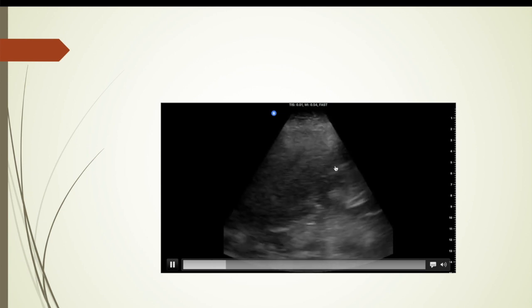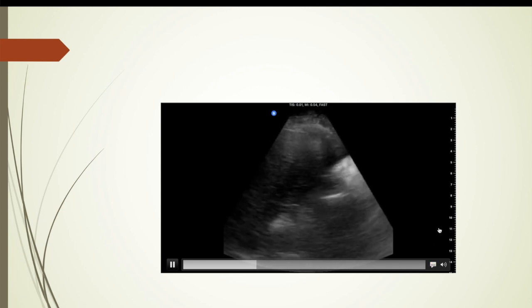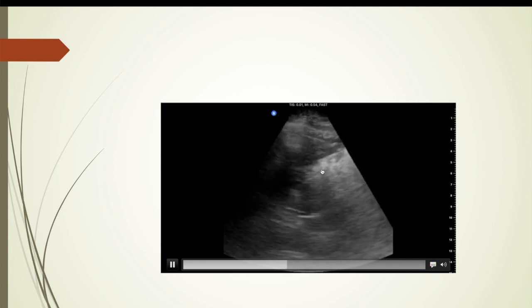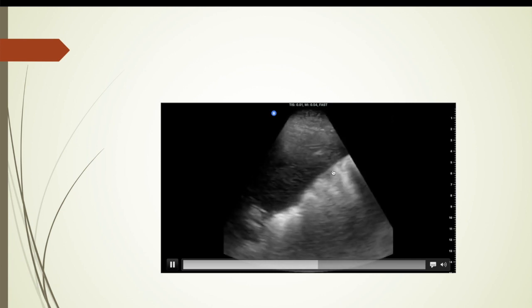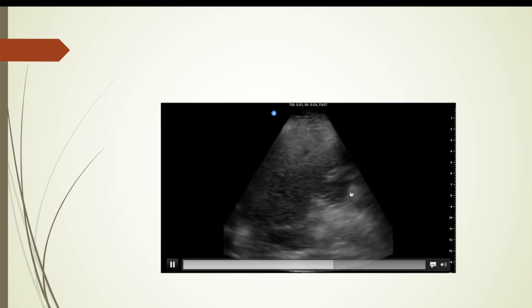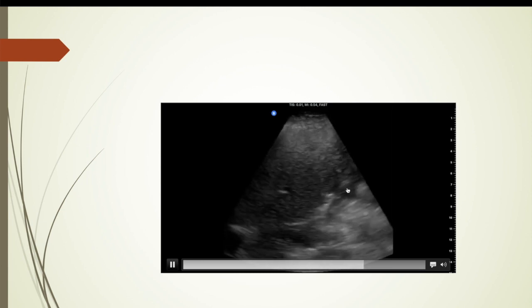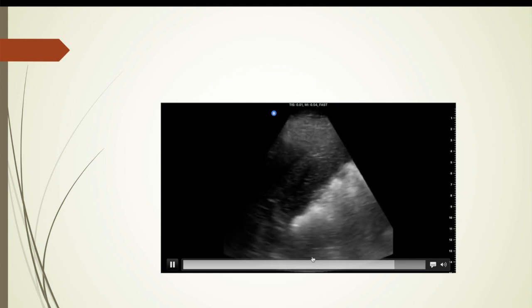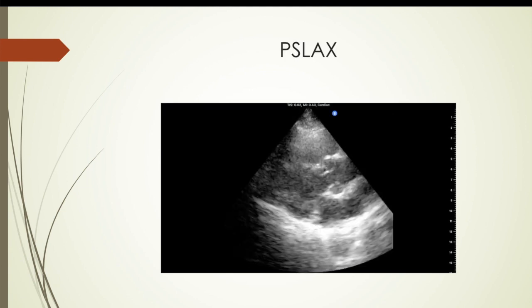Here is the right upper quadrant — liver. This is Morrison's pouch, the kidney-liver interface. The kidney's coming into focus here. She was in not the best position for this, but in any case it's obviously a negative FAST for her.